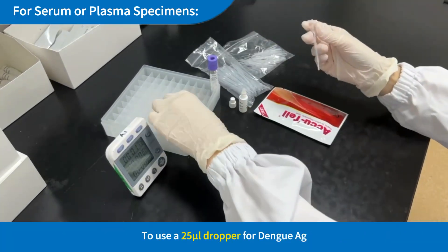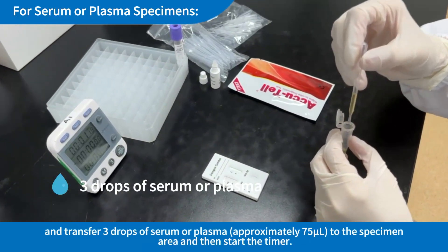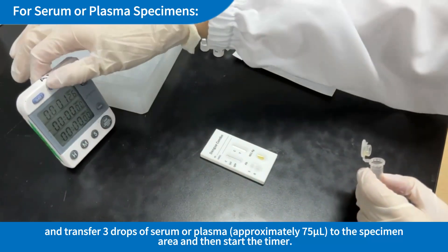To use a 25µL dropper for Dengue AG: Hold the dropper vertically and transfer 3 drops of serum or plasma (approximately 75µL) to the specimen area, and then start the timer.